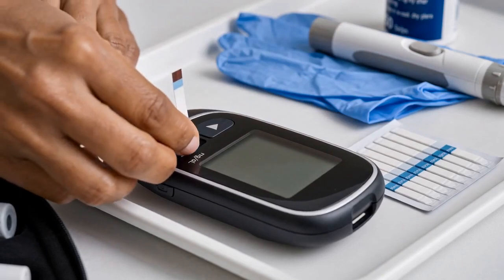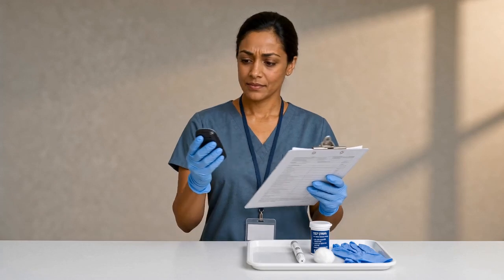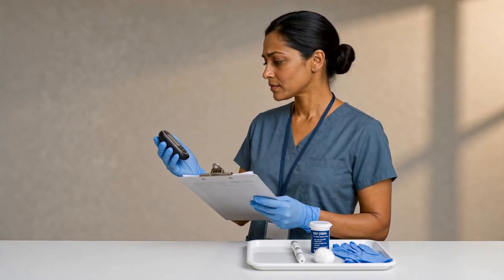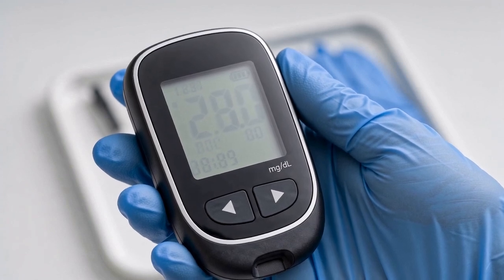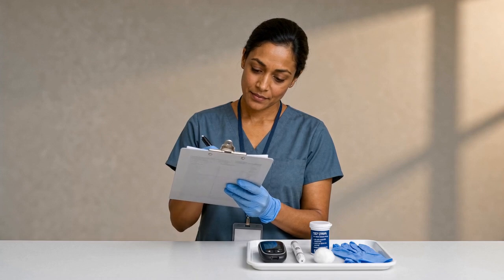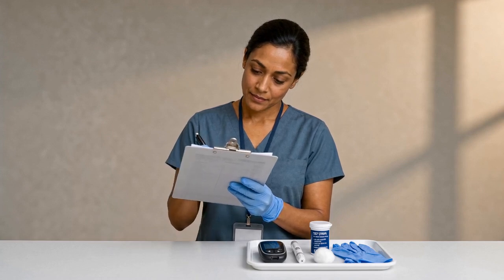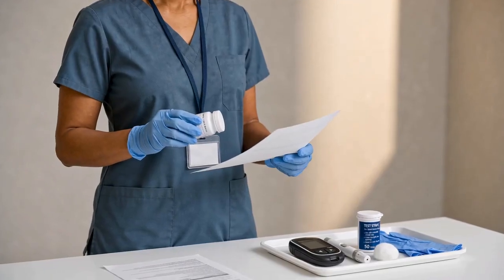Never independently change an insulin dose or substitute your own judgment for the resident's prescribed plan. If the resident is not eating as expected, has an abnormal glucose reading, or the situation does not match the instructions you have been given, follow the prescribed parameters and contact the appropriate licensed healthcare professional when required.